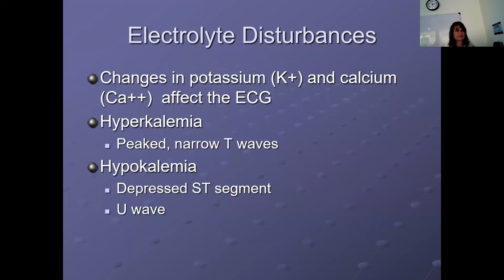So with high potassium, you get peaked, narrow T waves. High potassium, you get high T waves. As I spit and get my audience all wet. Every year I do this, and every year everybody gets it right on the test. So that's why I go ahead and make a fool out of myself. People who have graduated say, oh yeah, I remember the peaked T waves for high potassium. So you'll see me 3 years from now and you'll remember that. So high potassium, peaked T waves.